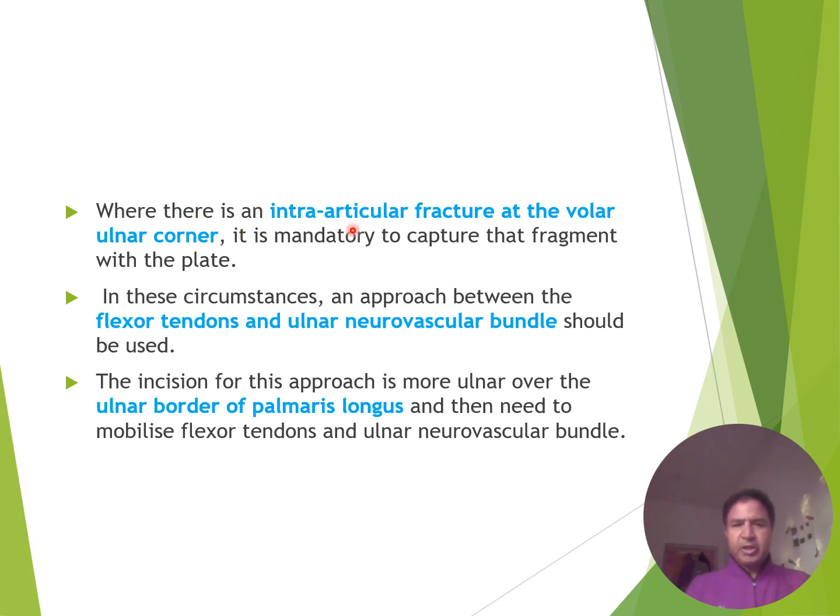Where there is an intra-articular fracture at the volar ulnar corner, it is mandatory to capture that fragment with the plate. In these circumstances, an approach between the flexor tendons and ulnar neurovascular bundle should be used. The incision for this approach is more ulnar, over the ulnar border of palmaris longus, and then you need to mobilize the flexor tendons and ulnar neurovascular bundle.